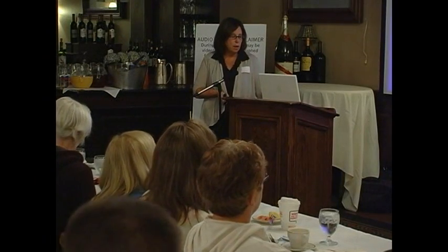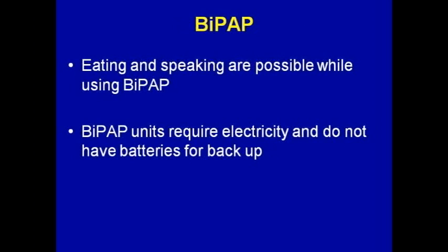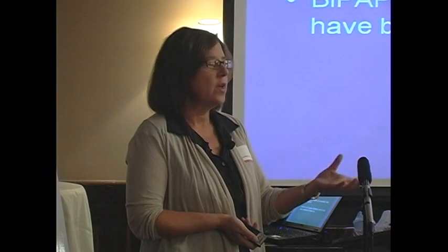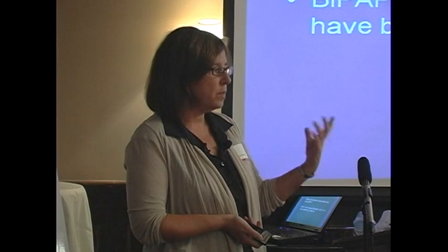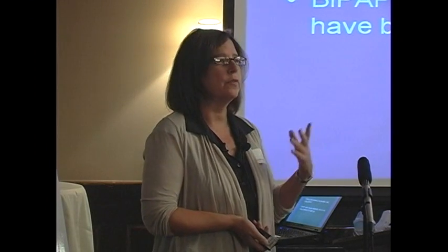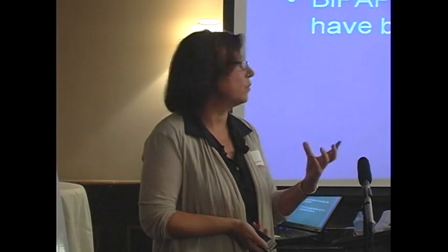People who use BiPAP usually start using it just at nighttime, or if they take a nap, or if they're lying on the couch. People don't usually eat while they're using the mask, but it's on and off. People can speak, people can eat. It's an intermittent thing. It's a form of support. It doesn't take over breathing.